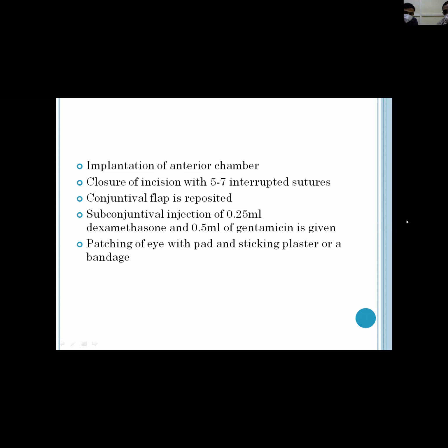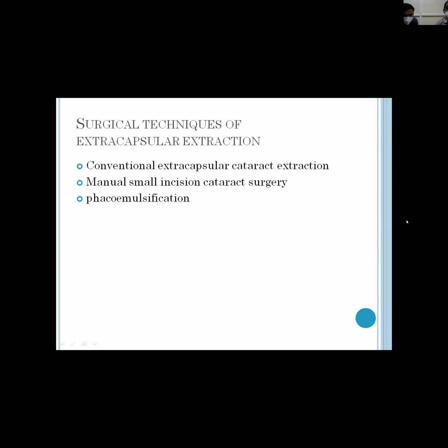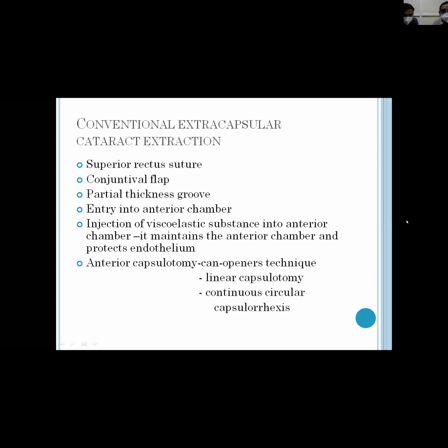Forward it. So whenever you mention various steps, the conjunctival flap is done with the particular scissors, from 10 to 2 o'clock, the conventional extracapsular. And entry at 12 o'clock is made with a Lewin blade. So that also you should mention. Okay. Next.